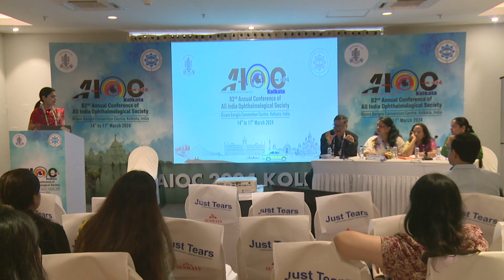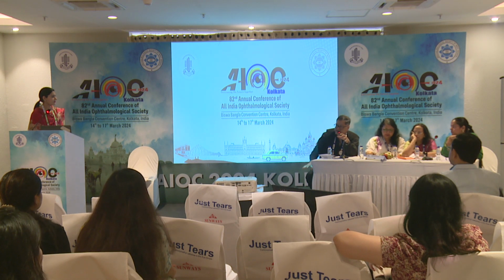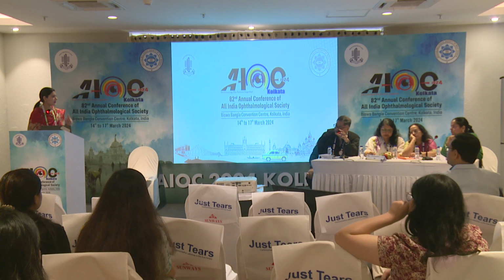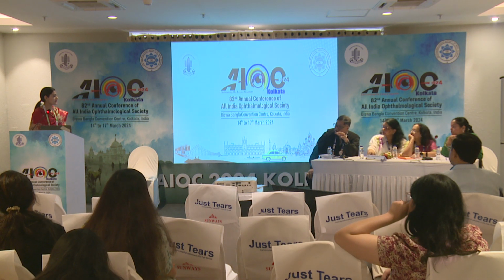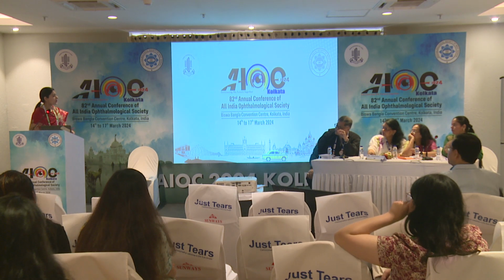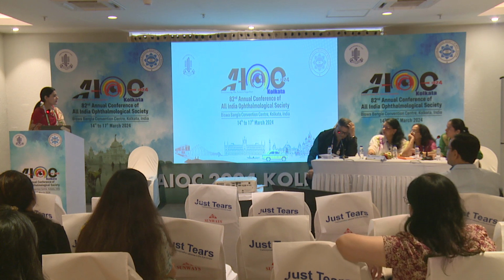Okay, sir. In your next series, you assess the UBM or anterior segment OCT for all the cases. It should be a protocol. Yes, sir. So the UBMs that I showed, UBMs are done for all these patients. You have done it for all the patients? For all the pediatric patients that came in, because we have a separate day for pediatric ophthalmology.